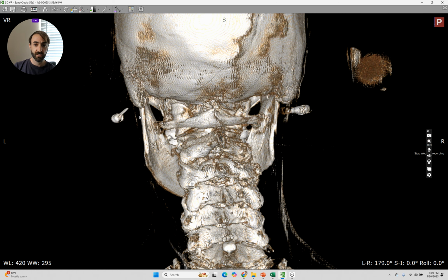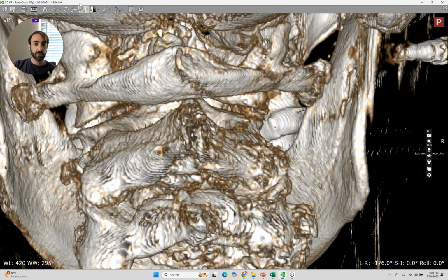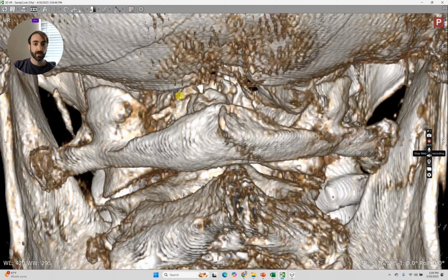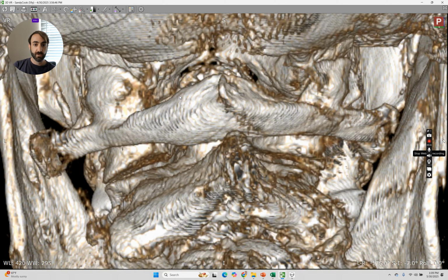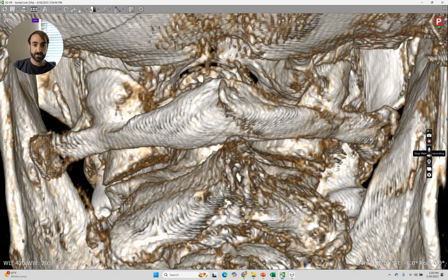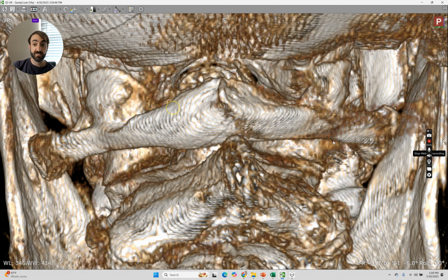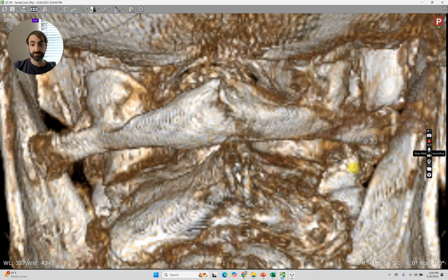So you can see if we took the analysis at this angle, we would see maybe more C2 rotation than if we actually did the analysis at that 4 degrees, 176, that's straight. And so let's go ahead and zoom in on this posterior arch. And to get our S-line, we really want that posterior arch and the anterior arch to be overlapping. So here's the back of it, the front of it. I just tilt it a little bit like that. And then we play with the density till we can really see a lot of what we're trying to measure.